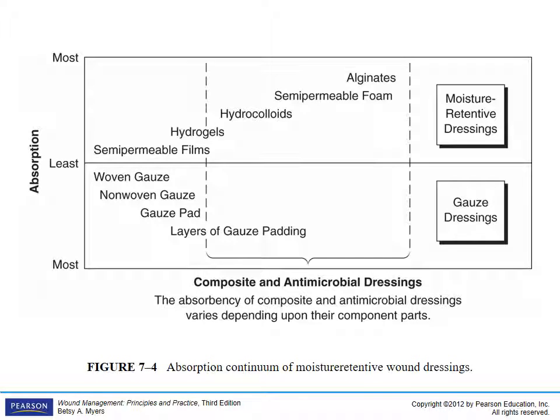All right, here's another one that talks about absorption. So let's say you have a very wet wound. There's a lot of enzymes. There's a lot of fluids coming from this wound. So the most absorptive and the least absorptive are on this figure here. So this has both composite and antimicrobial dressings.